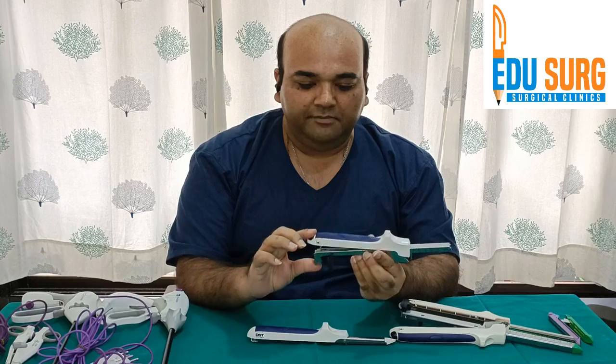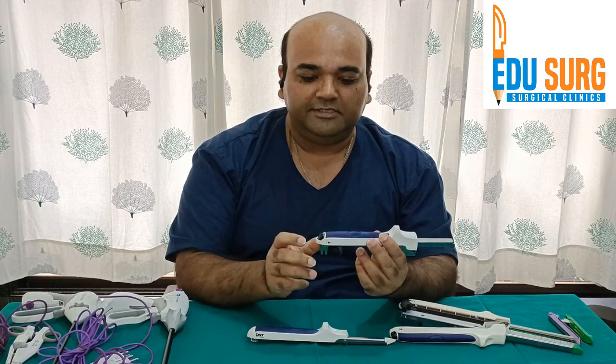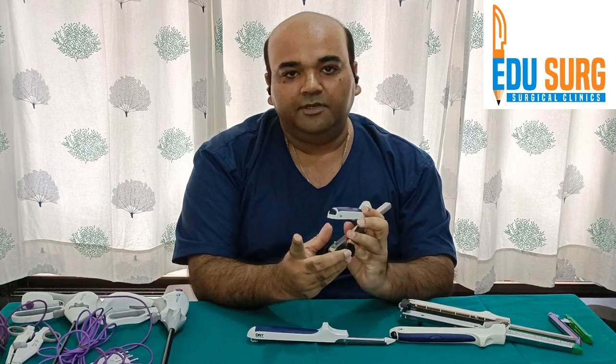This is the locking mechanism of this stapler. Here you can see it is locked. You have a knob at the back by which you can open the stapler.